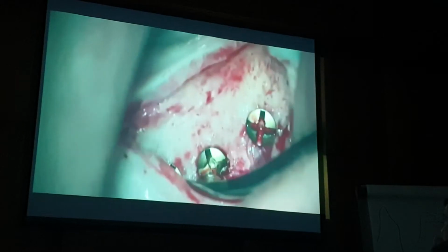But now you can see something amazing. Look at that bone regeneration. No particulate, 0, because that TCP resorbs 100%. And because it was a calcium-releasing bone graft material, and here's the original ridge right here. Now I've got a 12 millimeter wide ridge with good cortical bone. Watch the vascularity of this bone when I remove these screws.